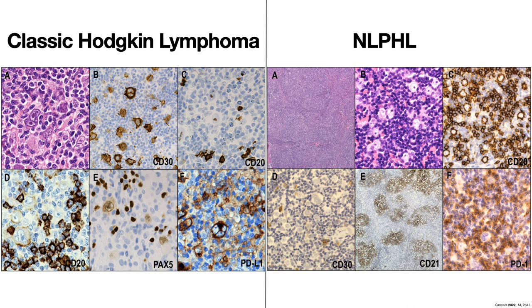Hodgkin Reed-Sternberg cells are also highly associated with PD-L1 expression, as shown in figure F. On the right side, the majority of nodular lymphocyte predominant Hodgkin lymphoma cases are characterized by a nodular growth pattern. These nodules, seen in figure B, consist of abundant small reactive B lymphocytes, epithelioid histiocytes, and intermingled neoplastic LP cells, which are nicely highlighted by CD20. The LP cells express CD20, demonstrating an intact B cell program, and are CD30 negative, although rarely can be positive.